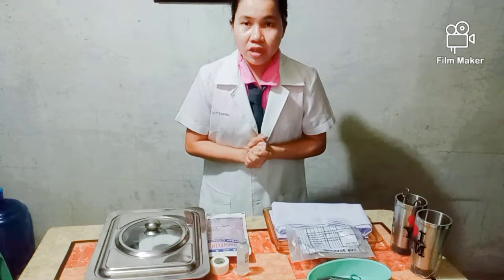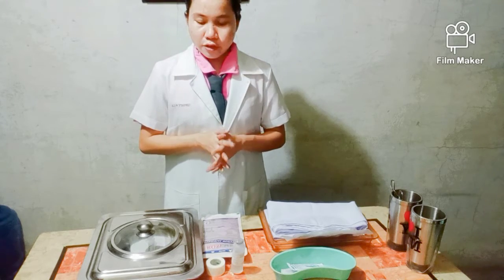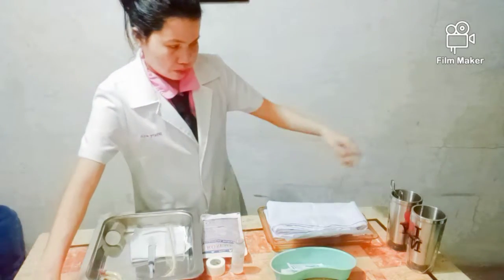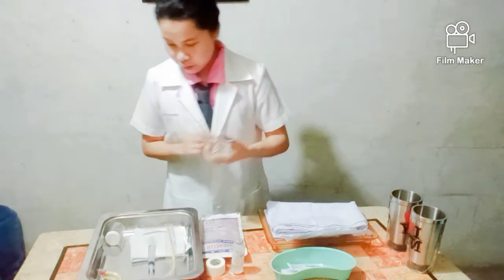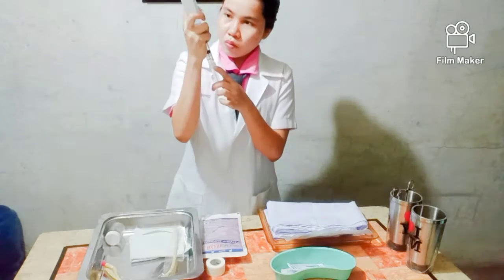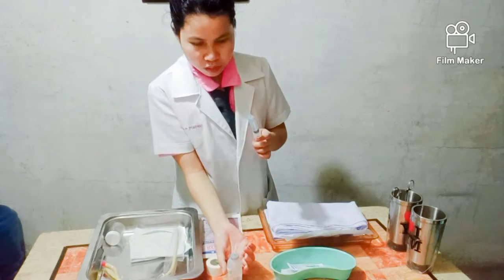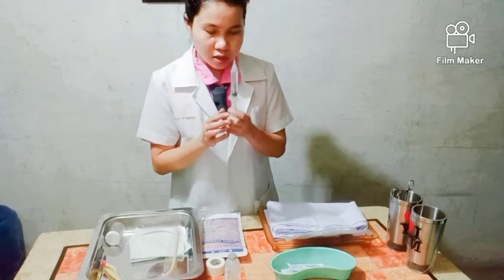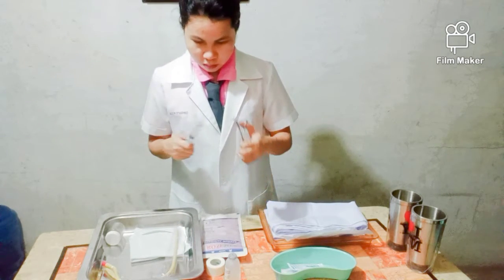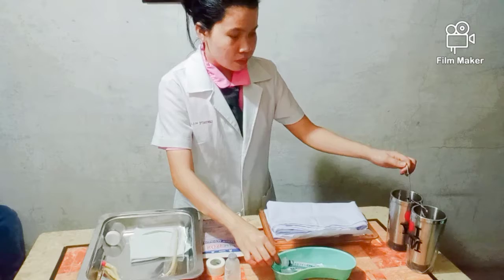Those are the materials needed for urinary catheterization. Now we will be preparing 10cc of sterile water using the syringe. It should be 10cc of sterile water. Put it in the kidney basin.